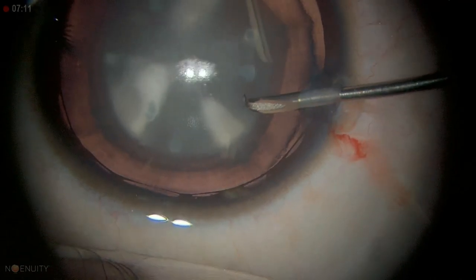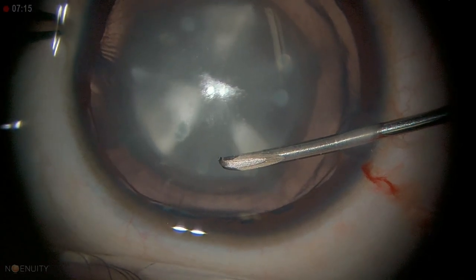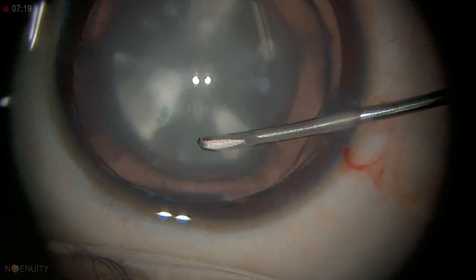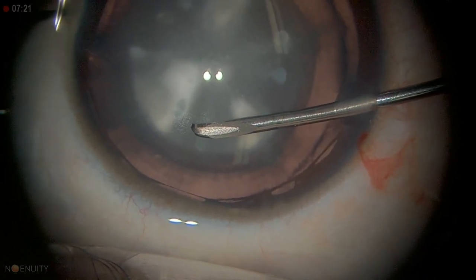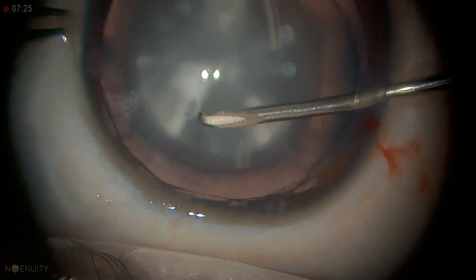In this case we have a predetermined capsulotomy size, because you can see the nuclear border — that's the size we want to achieve. You can see the shiny surface here; I'm going to make the stab incision there.